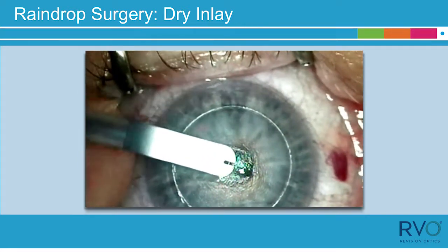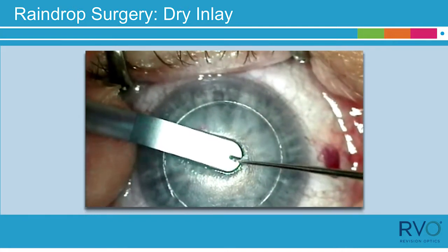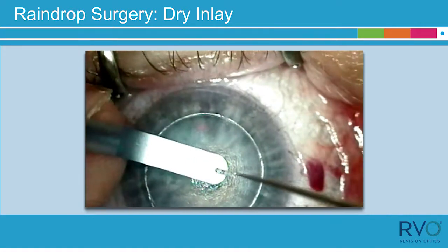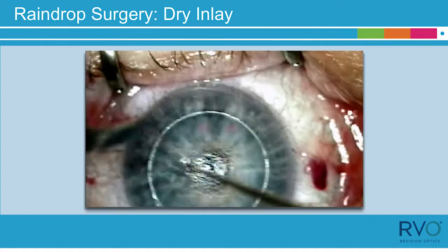In this video, the inserter became a little dry at the inserter tip after multiple attempts at delivery. The dry inlay shifted back to the inserter nest as shown. It is not recommended to keep trying to deliver the inlay with the dry inserter as shown in the video.